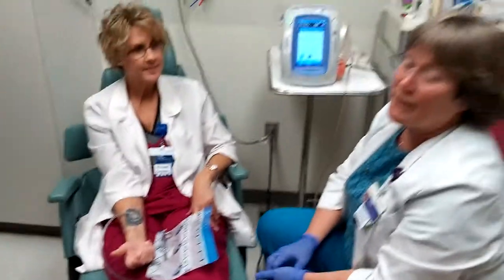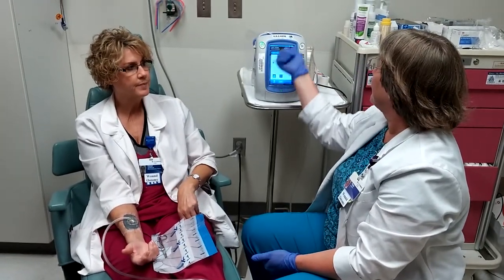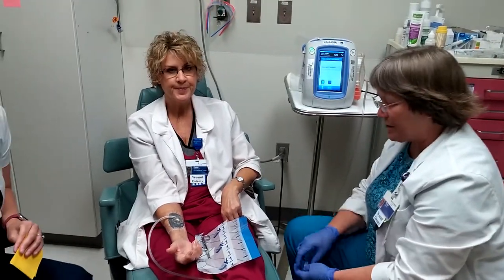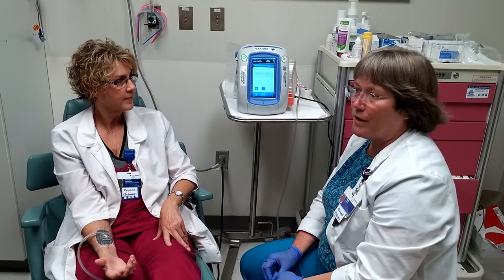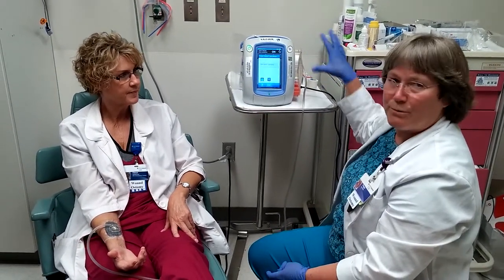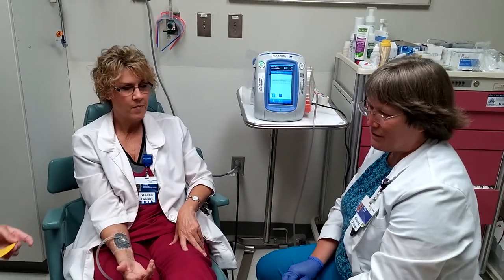You might also have a battery alarm, so make sure the battery is good, it's plugged in and charging — it may have been unplugged for a long time. A canister full can also be an alarm, so just keep an eye on that. If they're going through a lot of canisters, note that and note the quality — whether it's thick bright red blood or just clear serosanguinous, which is fine.